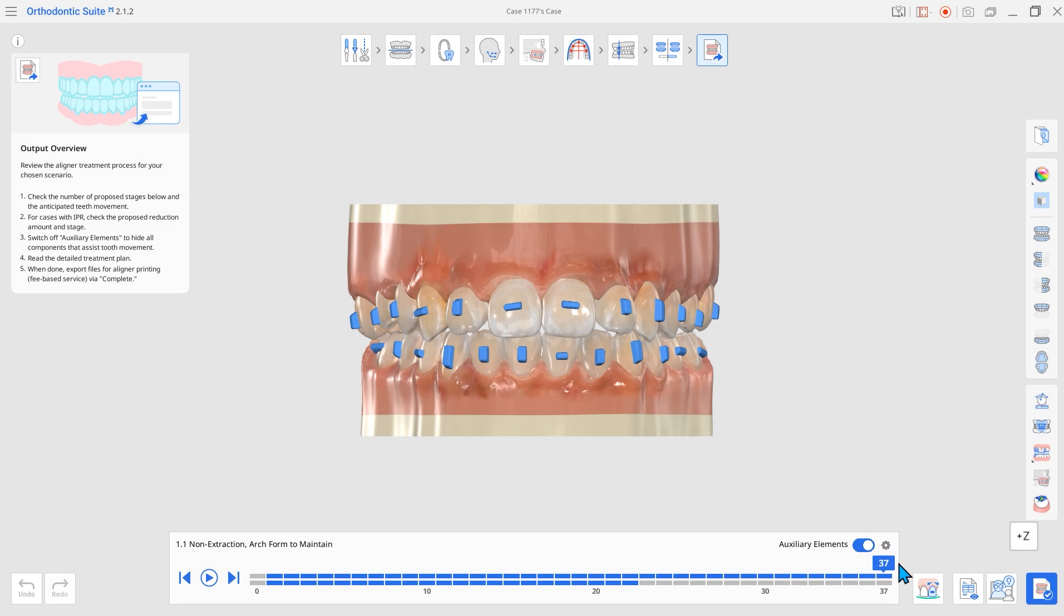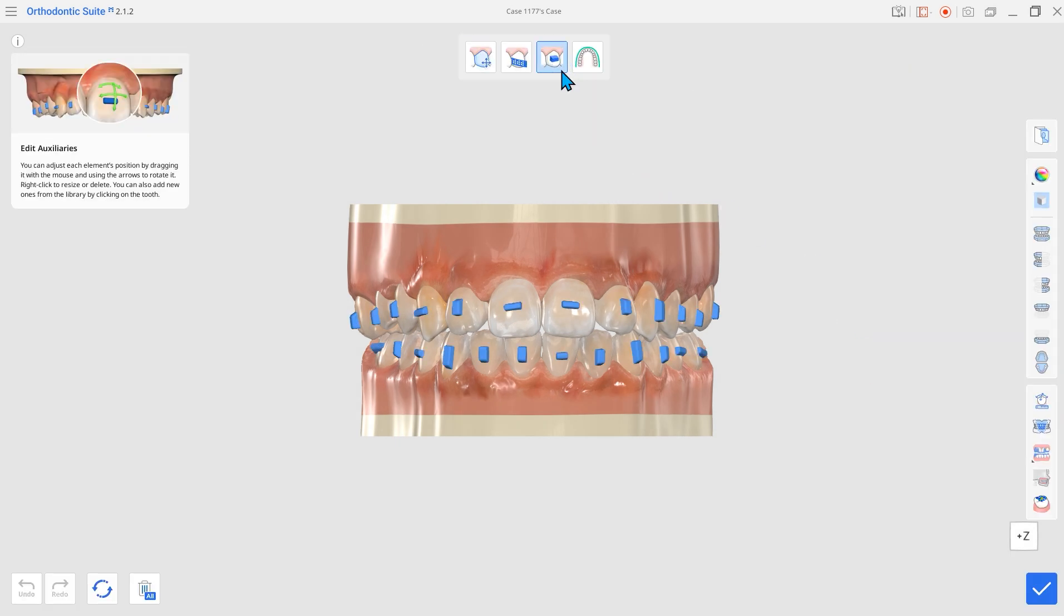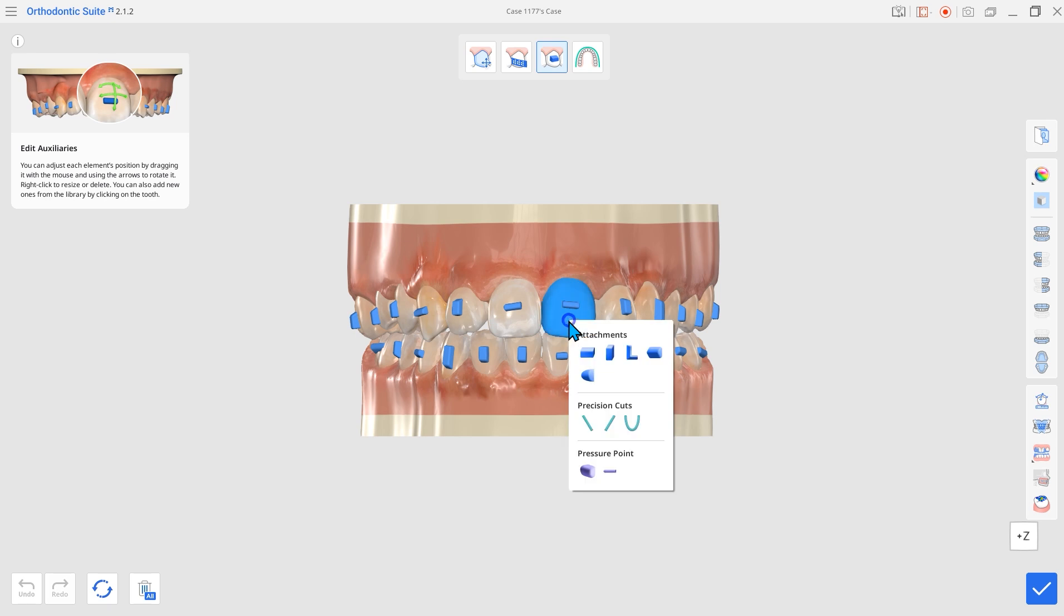Second, attachment library has been expanded with new options. You'll see that seven elements of three types have been added.